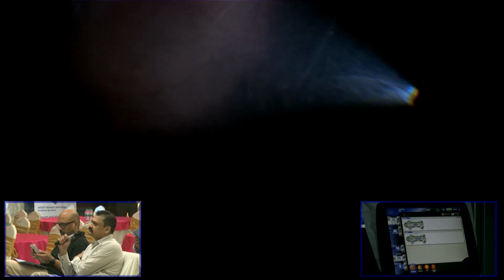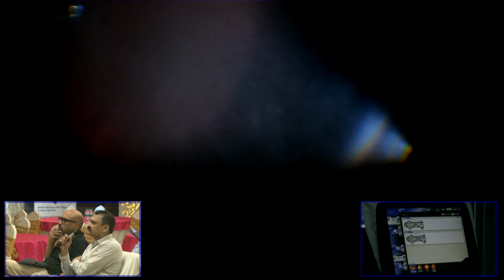Will you increase the light a little? So now you are trimming inferiorly, or we are not able to actually see properly? Yeah, inferiorly I have done. Okay. Now I am trimming temporally. Okay. Yeah, we can see the macula here.